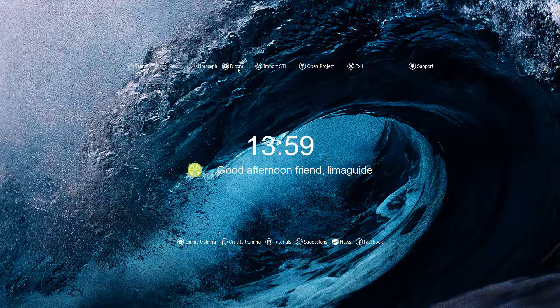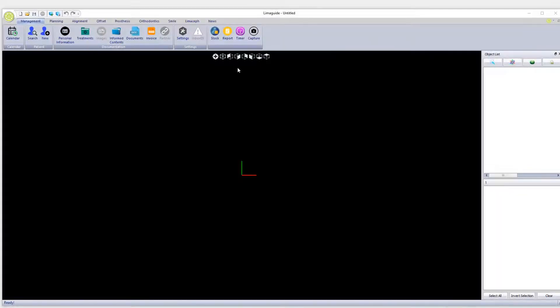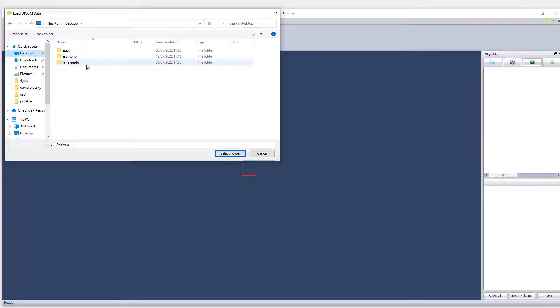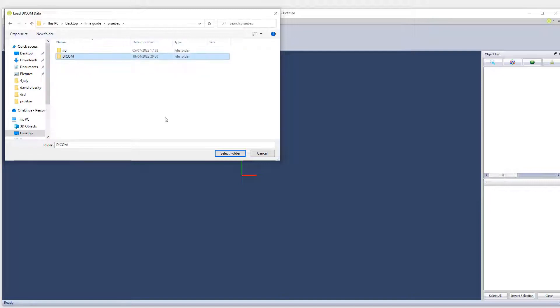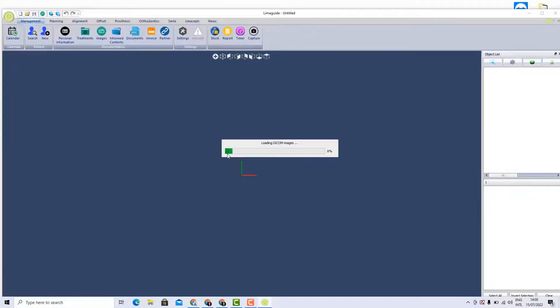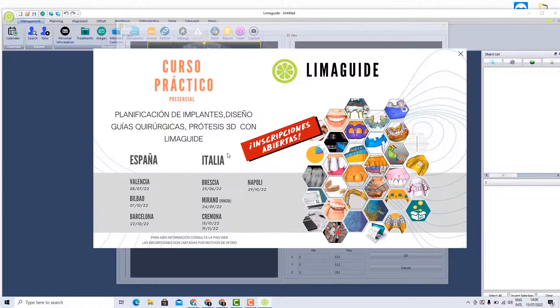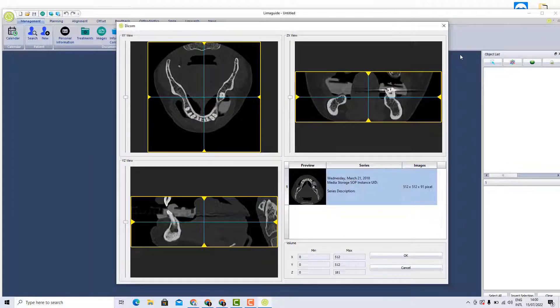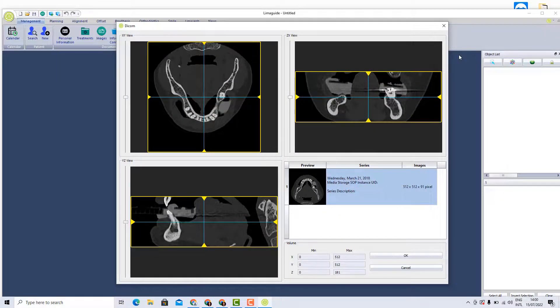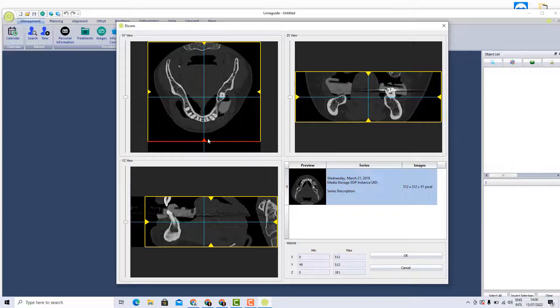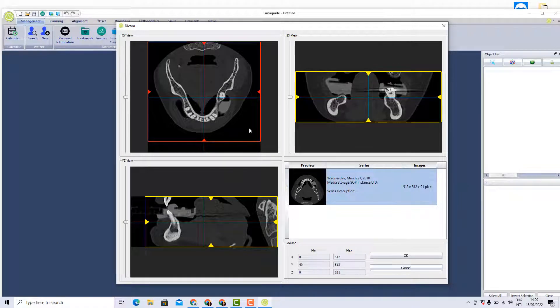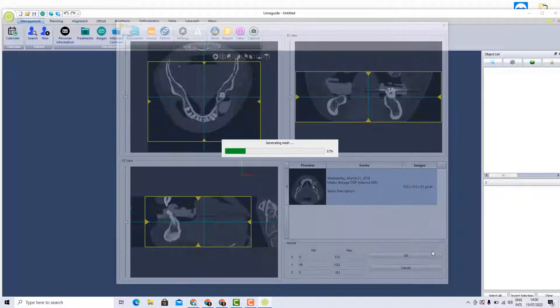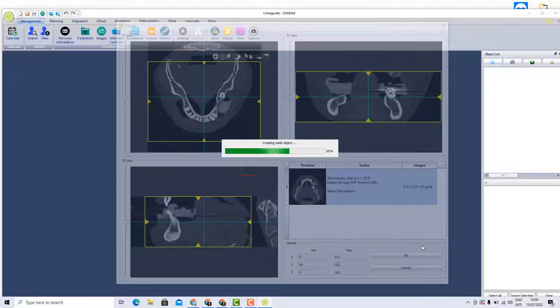For example, let's start. I'm gonna import a DICOM. Here I have the DICOM. It's very important to know that Lima guide can only read DICOMs that the DICOM file shouldn't be compressed, otherwise Lima guide will not be able to read it. So here, everything inside of the yellow and red box will be read by the software. We press on the OK button.